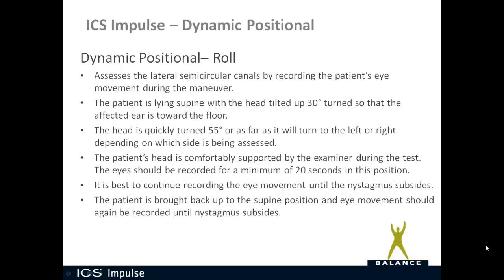So the minimum is 55 degrees, the maximum would be 90 degrees, but you want to turn the head as far as it will go to the side. So again, patient's laying supine, you quickly turn the head to the left or to the right side. The patient's head is comfortably supported by the examiner during the test.